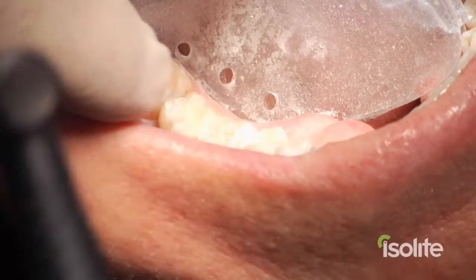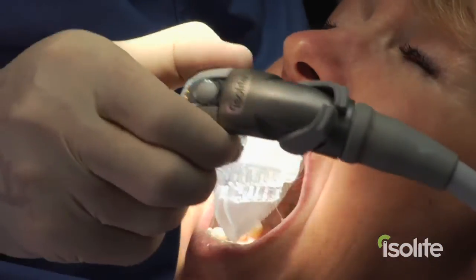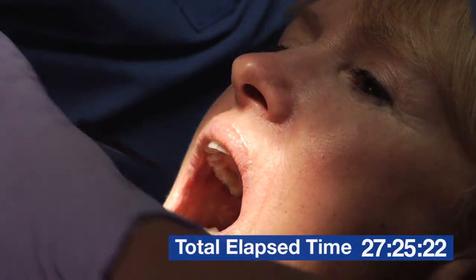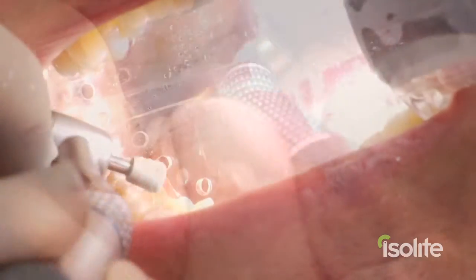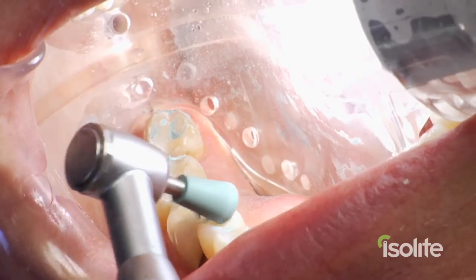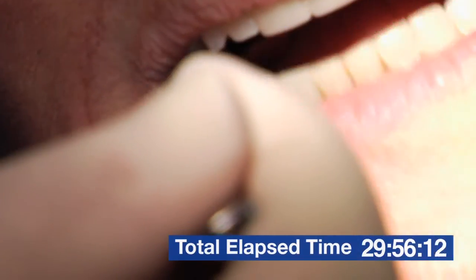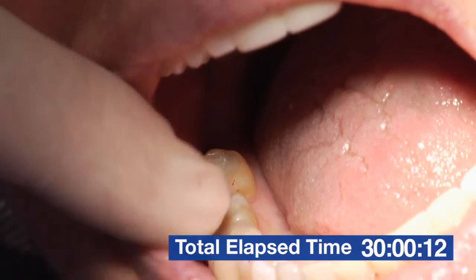Okay, we're going to check our occlusion now. Open real wide, pop this out. Islite has allowed me to do three composites in about 30 minutes. And no rubber dam.